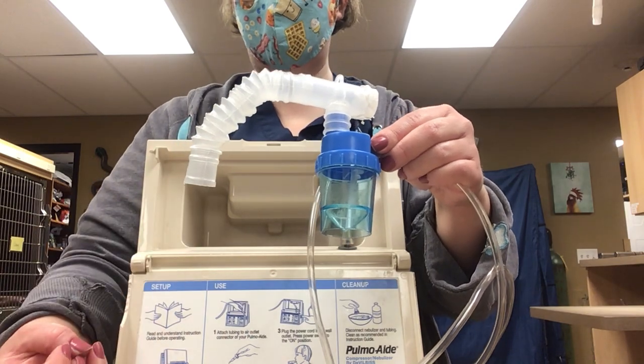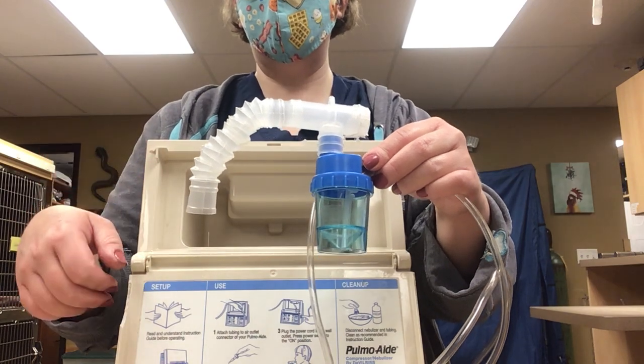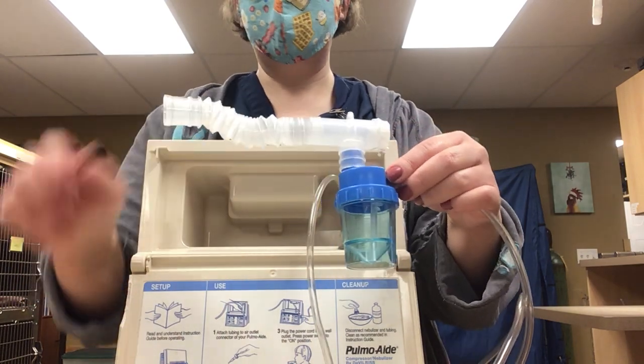You should be seeing kind of a foggy mist come out of here. If it's not, go back through everything, make sure it's set up appropriately. You can always call if you have questions. But that should be it.